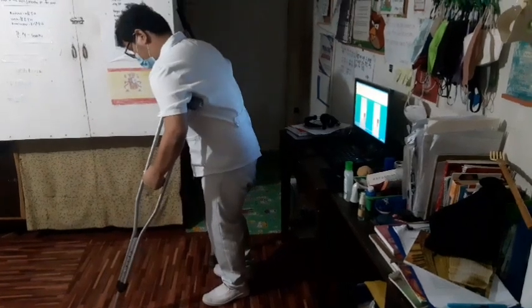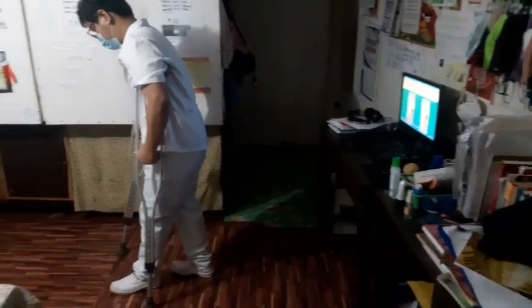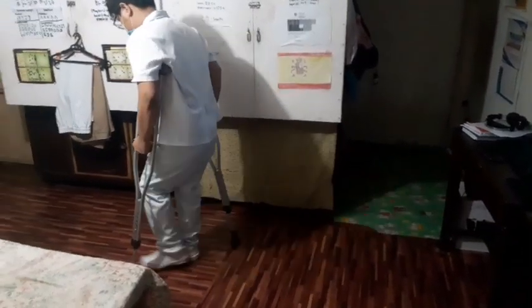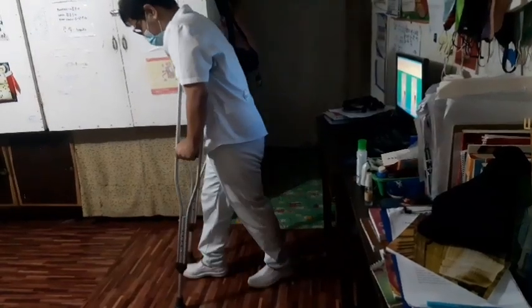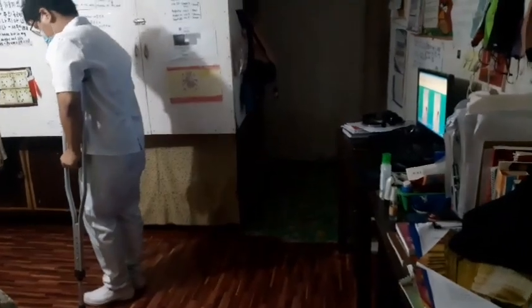Beginning with the 4-point gait, this is how it is done. Advance the right crutch, then the left foot, then the left crutch, then the right foot. Another procedure is the 3-point gait: advance both crutches and the affected extremity at the same time, then advance the unaffected extremity. This is how it is done.